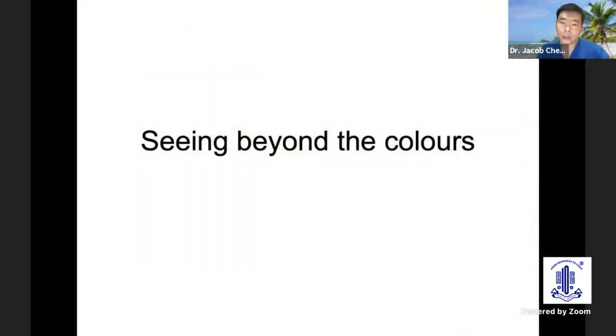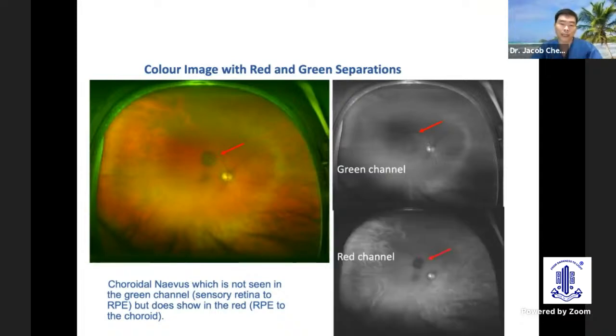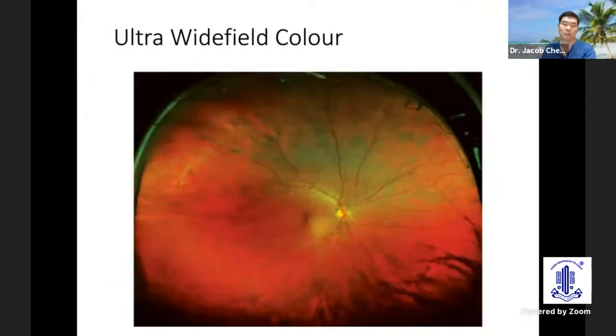How about seeing beyond colors that the Optos gives? Again, an earlier speaker has alluded to the color image with the red-green separation. You can see the picture on the left-hand side of the choroidal nevus. The green channel highlights the sensory retina to RPE, and the red channel, or the red laser, shows the deeper choroidal picture. So you can see that this choroidal nevus does not appear on the green channel, but on the red channel, which highlights the choroidal pathology.